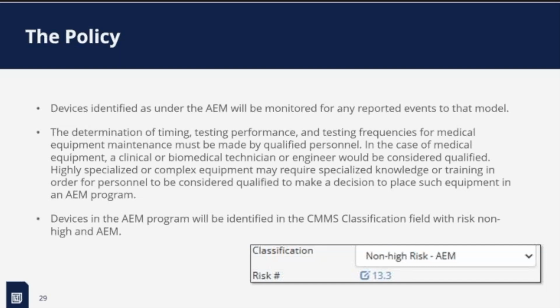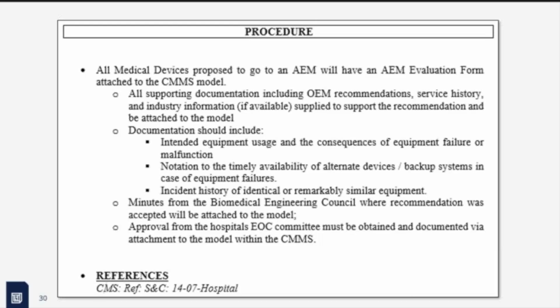And that's how you sort of group all the equipment together so you know what you're reporting on. And that goes into the code language where you're looking at 100% completion, instead of trying to search by risk number of the equipment, our work orders have that classification on it as well. So we try to group them into four buckets of work for the most part.